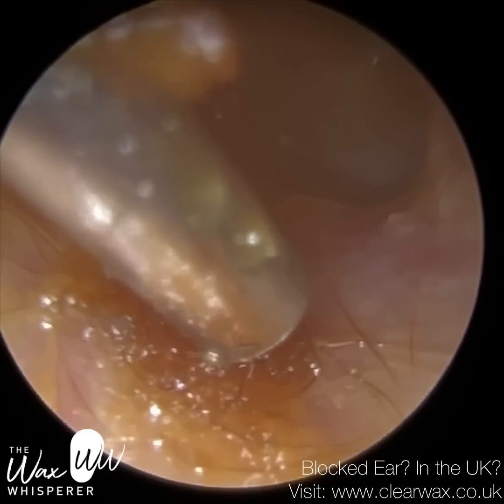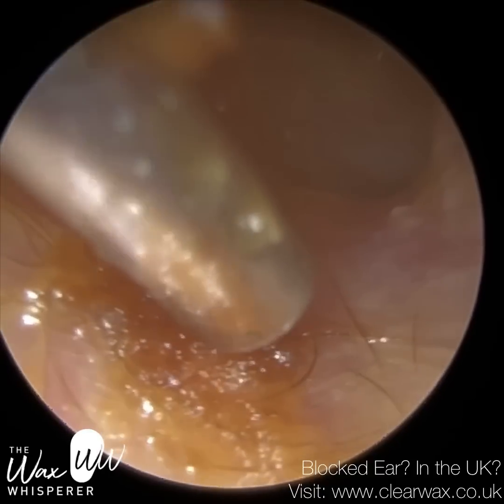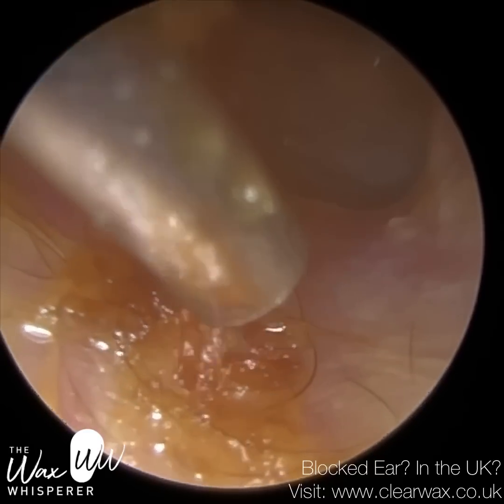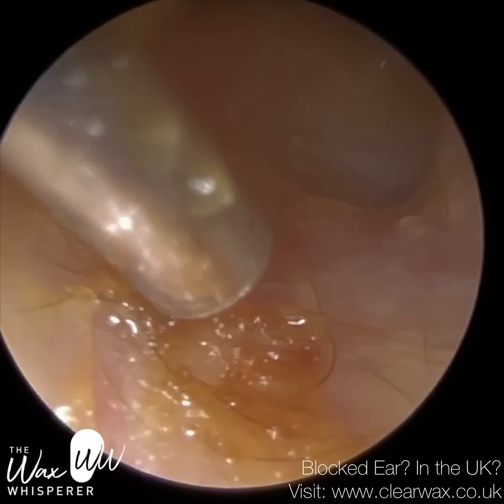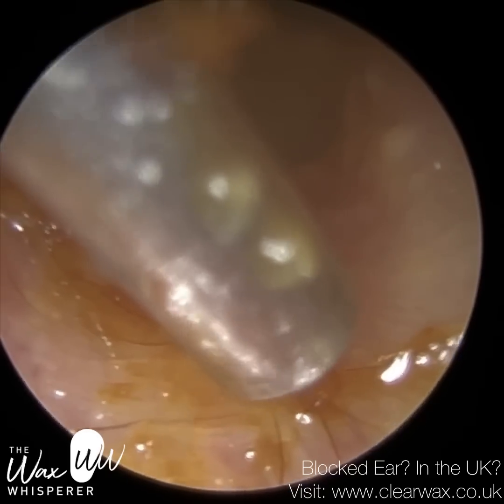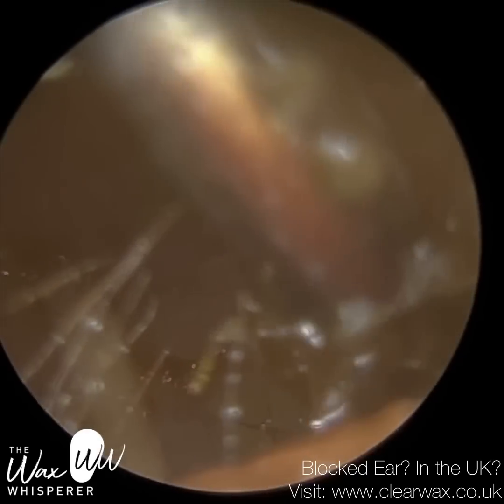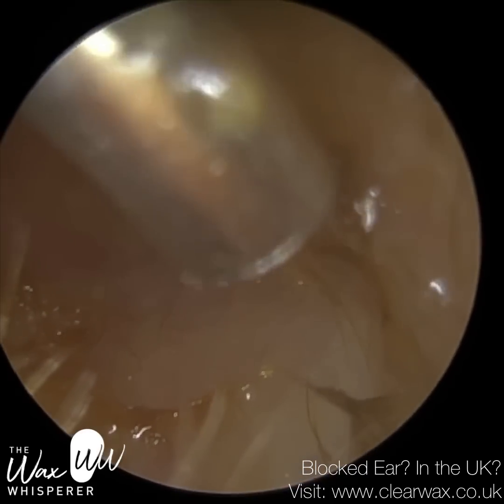So I'm just mopping up now. Got to be really careful. We're just on the bony part here, just hovering over. If it comes away, brilliant. If not, we're going to leave it because I don't want to scrape the patient's ear canal and potentially cause them any trauma. So we're on the bony part here. If it was a bit closer to me, it's the cartilage portion, we could apply a bit more pressure. The skin is a lot thicker there, so that acts like a buffer effect. So it's got a stronger defence, the cartilage portion, as opposed to the bony part of the ear canal. It's only a very thin layer of skin that coats that.